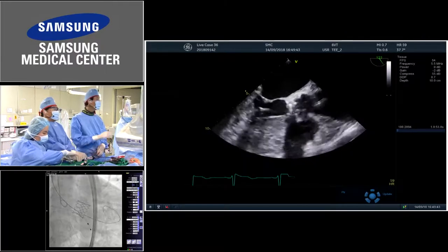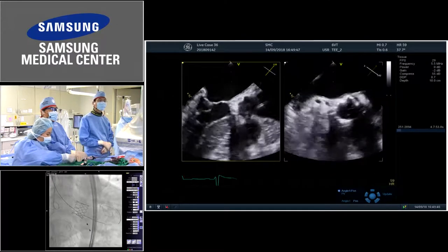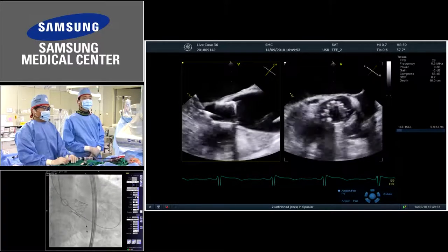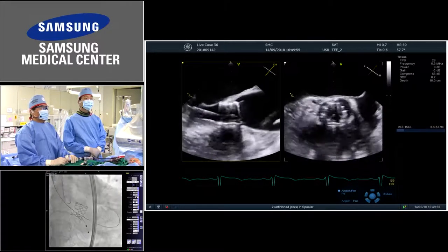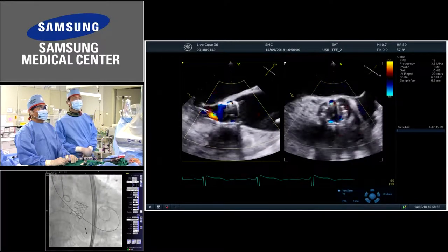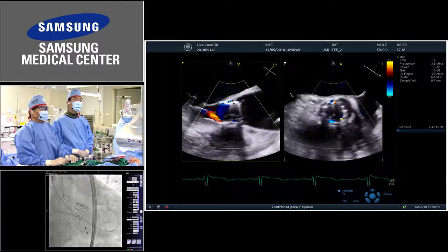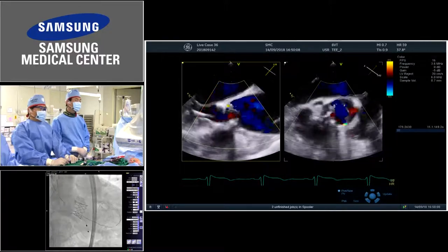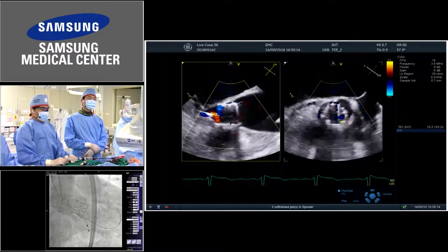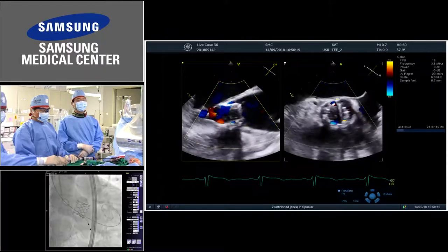I want to add one comment regarding what Eberhard just said, Dr. Gwon. This is definitely a perfect implantation. Still, a remark I have, from bad experience, is that when you pull the catheter from the right with the stent, if the ostium of the right coronary had been pinched a little bit by the calcium or by the valve, you could have left the stent out and just pulled. I'll be careful next time. Thank you for your comment.